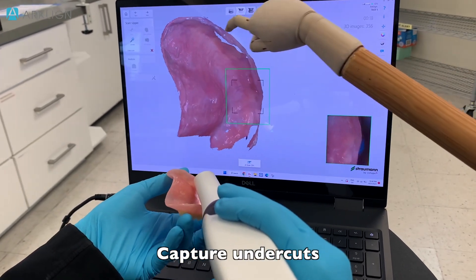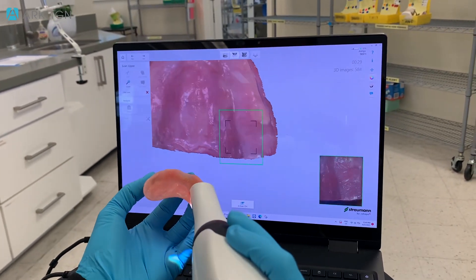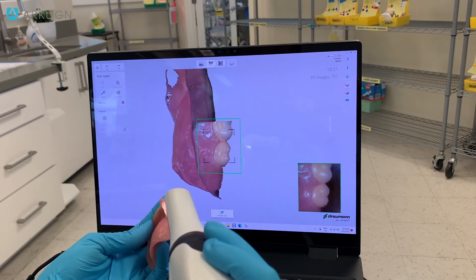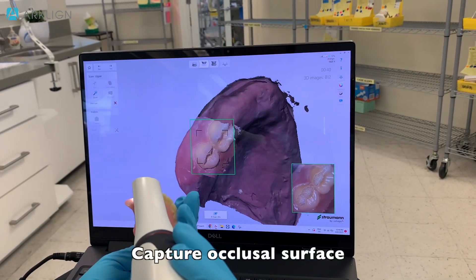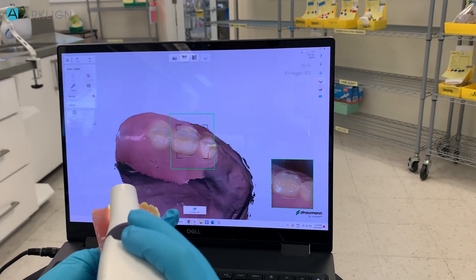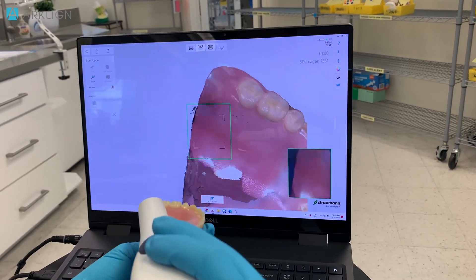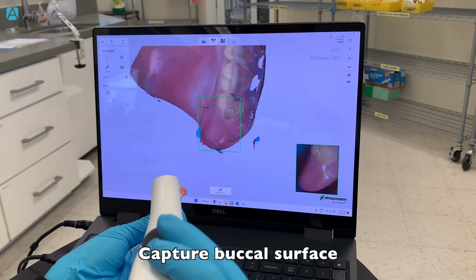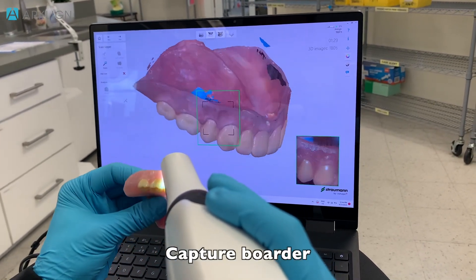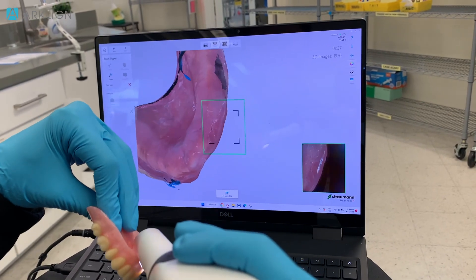Watch for undercuts. I'm going to slowly go to the border area, and go up to the occlusal surface. We're going to go around the occlusal, and then we're going to go to the buccal, and then we're going to patch the border area.